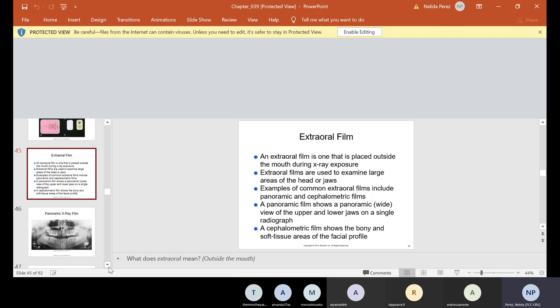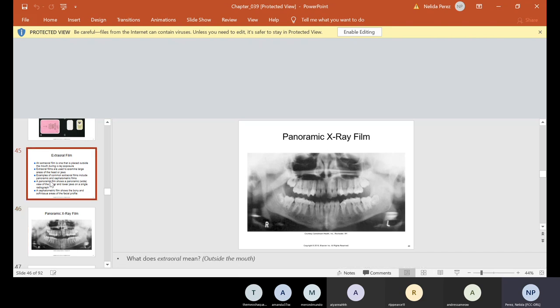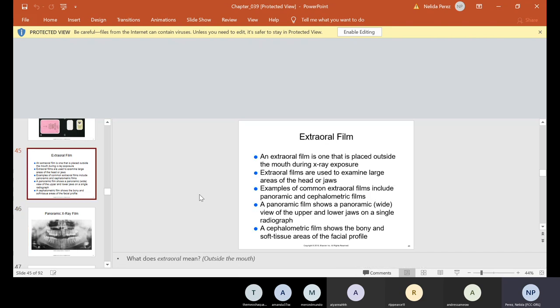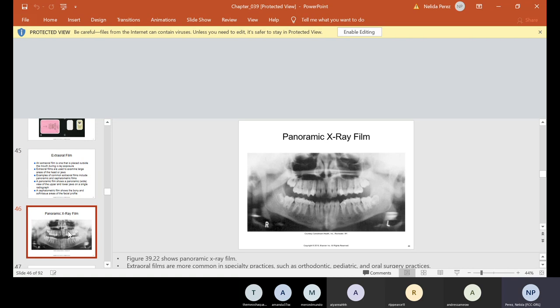A panoramic film shows a panoramic or wide view of the upper and lower jaws on a single radiograph — think about panoramic views on your cell phone, seeing the wide view of what you're looking at. A cephalometric film shows the bony and soft tissue areas of the facial profile. Here is a panoramic x-ray film. My arrow up here is pointing to sinuses; this is the nose; here are the wisdom teeth, some of which are not fully erupted. Sometimes we'll see wisdom teeth impacted.